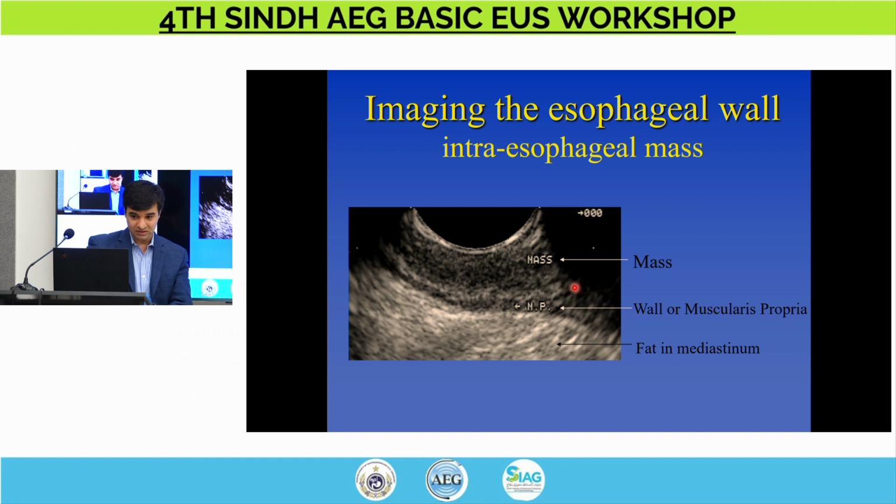And as you can see, this white line extends uniformly and separates this particular black area from the black area on the outside. And that tells us that this tumor is very unlikely to have invaded the muscle layer. Okay, so that's one important thing to look for. Fat is typically white. It's not a very good transmitter of ultrasound waves.